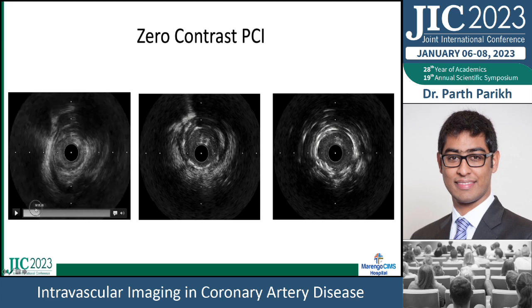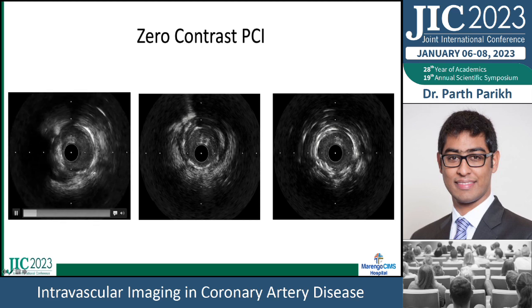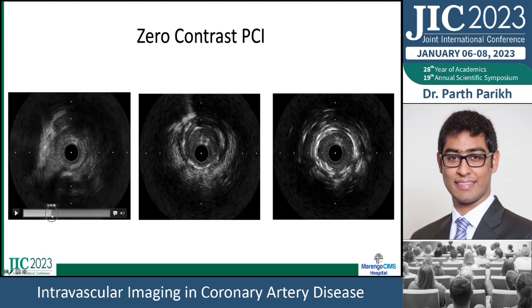And here, if we go back, you can see these are all stent struts. Then there is an unstented area, and this is the lesion where there is fibrous disease.